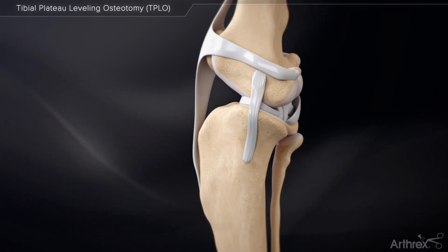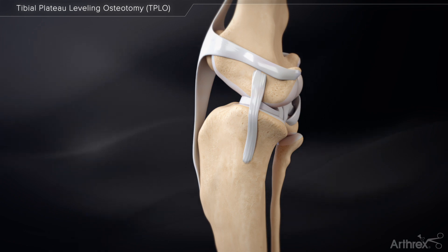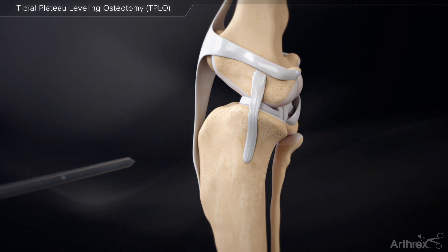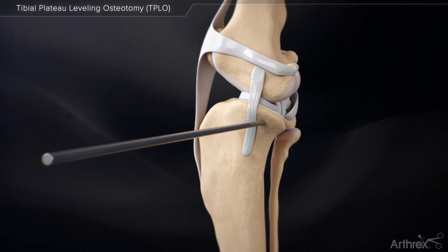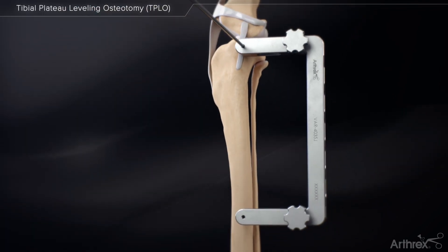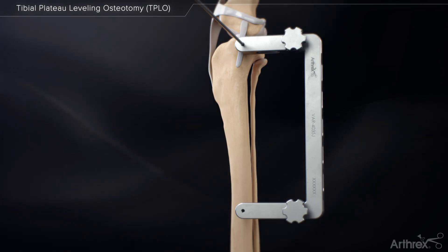Make a standard medial approach to the proximal tibia and identify the MCL. Place a jig pin 3 to 4 millimeters below the tibial plateau, distal to the joint surface, and caudal to the MCL. The jig pin should be inserted parallel to the articular surface and frontal plane of the tibia and perpendicular to the sagittal plane.